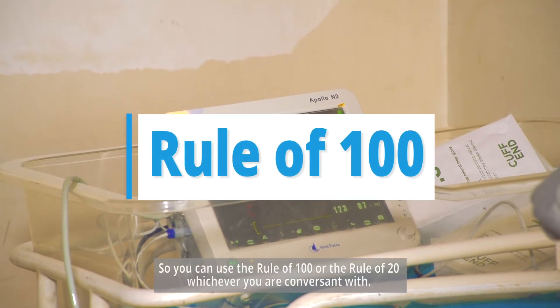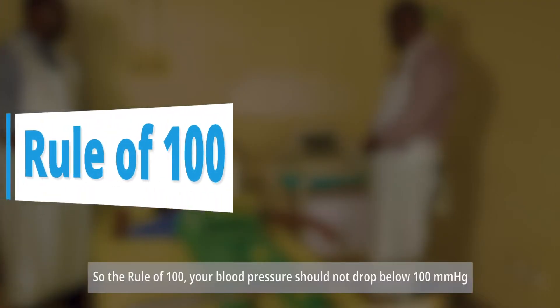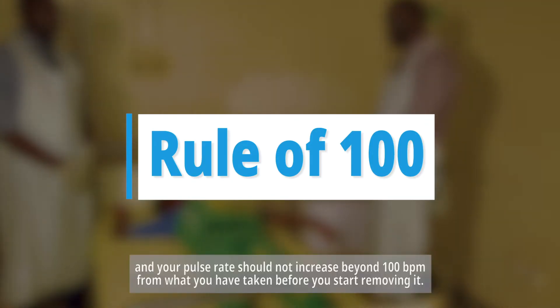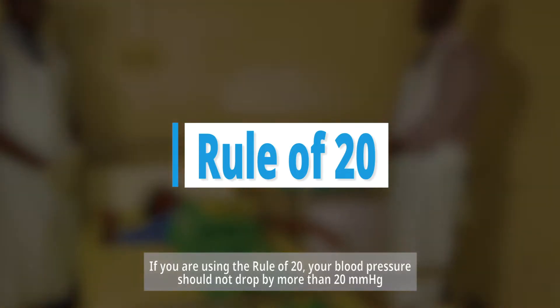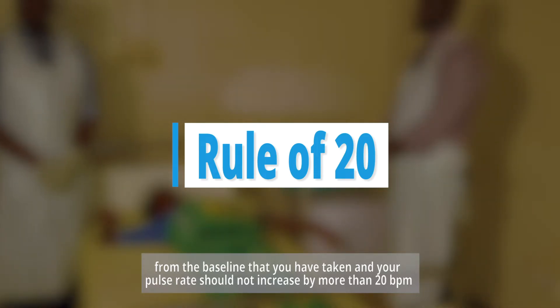You can use the Rule of 100 or the Rule of 20, whichever you're more comfortable with. With the Rule of 100, your blood pressure should not drop below 100 mmHg and your pulse rate should not increase beyond 100 beats per minute. With the Rule of 20, your blood pressure should not drop by more than 20 mmHg and your pulse rate should not increase by more than 20 beats per minute from the baseline.